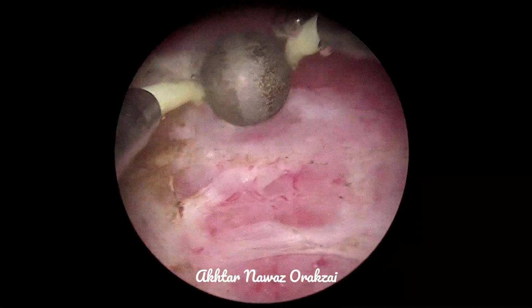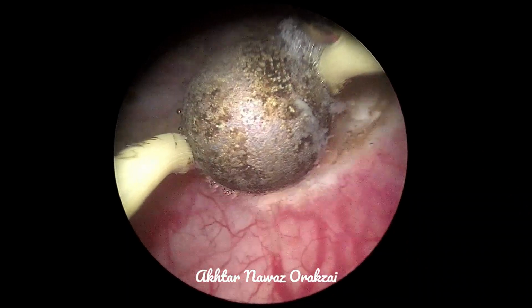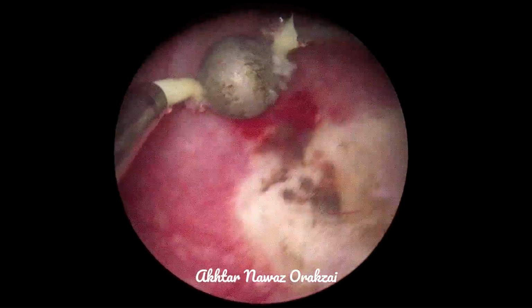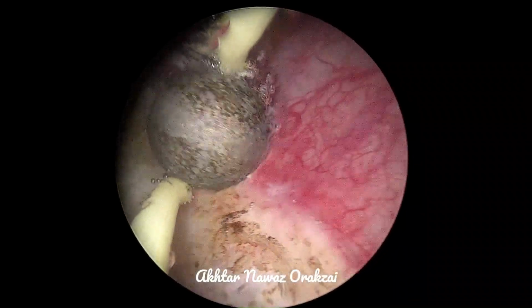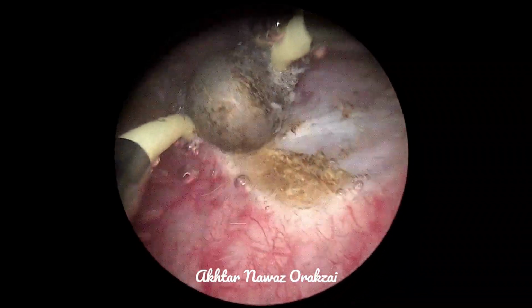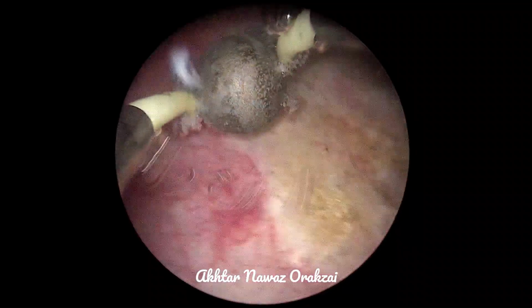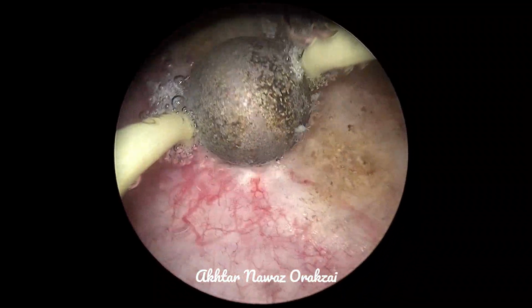I always coagulate the edges first because there are blood vessels running in the submucosal tissue. So if there is a cut edge, a resected edge of the mucosa, the majority of bleeding will be coming from those vessels. So coagulate the edges first and then coagulate the rest of the tissue. If there is deeper resection, even the muscular layer may be bleeding, so that needs to be coagulated.